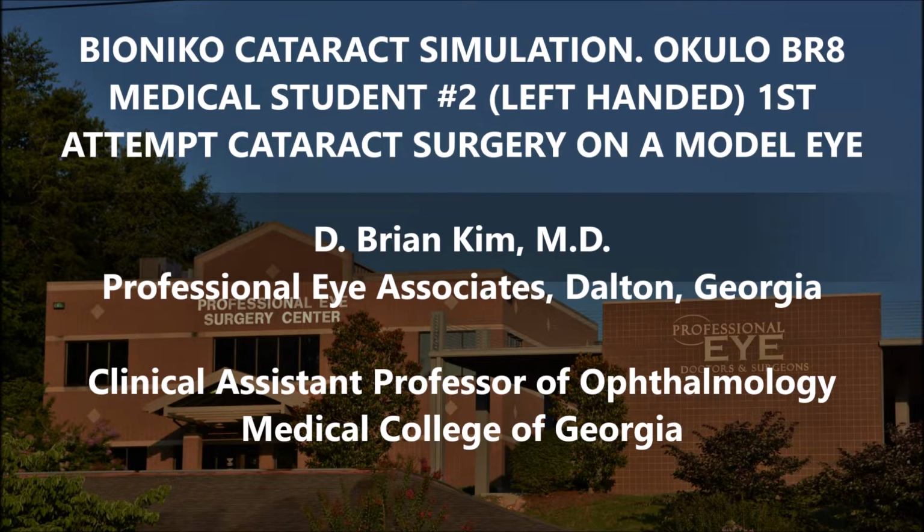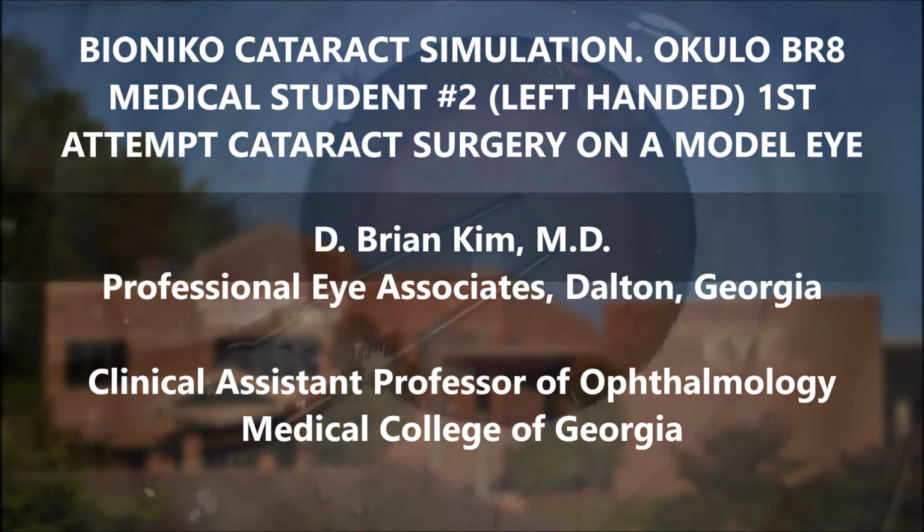Bioniko was clear to tell me that this is not tissue simulation cataract surgery, but more maneuver simulation cataract surgery, which means getting used to the different maneuvers within the incision and actually using forceps and instruments and phaco machine handpieces and choppers, etc., to be able to do cataract surgery.